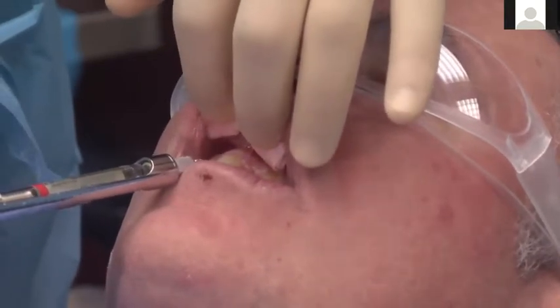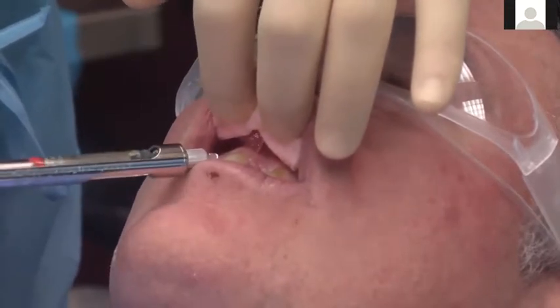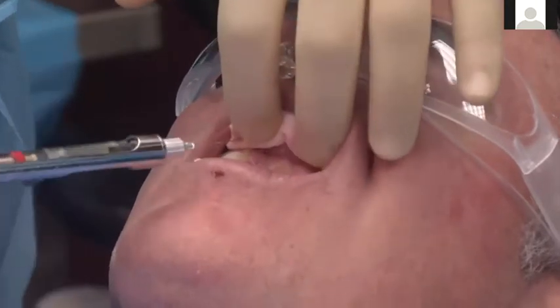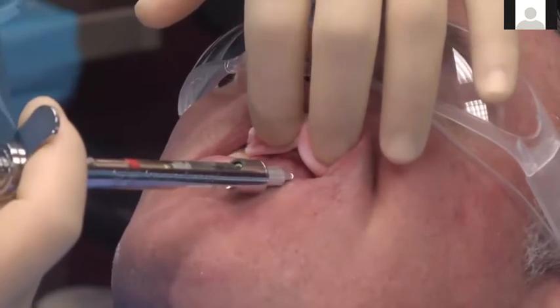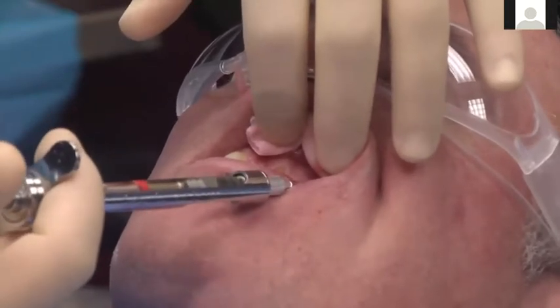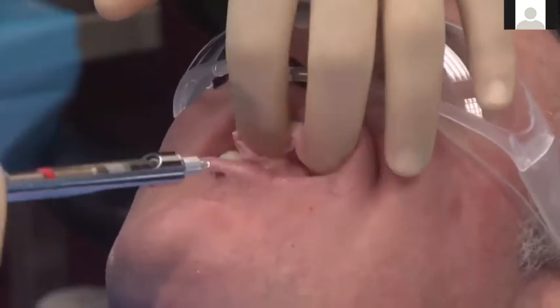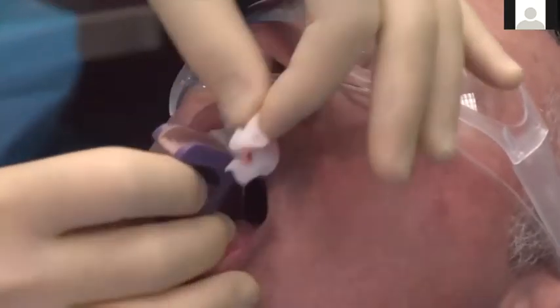So at the day of the surgery, this is the local anesthesia. Typically, most of my patients are sedated, but if your patients are not, obviously this is a sensitive area to anesthetize. So I typically do some really minor injections, just barely under the mucosa with lidocaine. Let that sit for about 3 to 4 minutes, and then come back and re-inject up higher in a stepwise fashion, just to not make the patient uncomfortable, with Marcaine typically, to get a long-acting local anesthesia. If the patients are already sedated, then I may start with Marcaine right away and not go through that exercise.